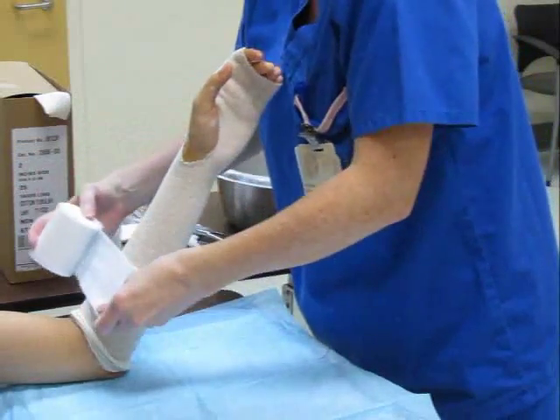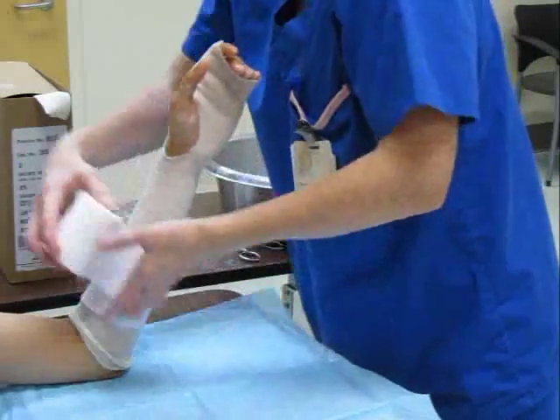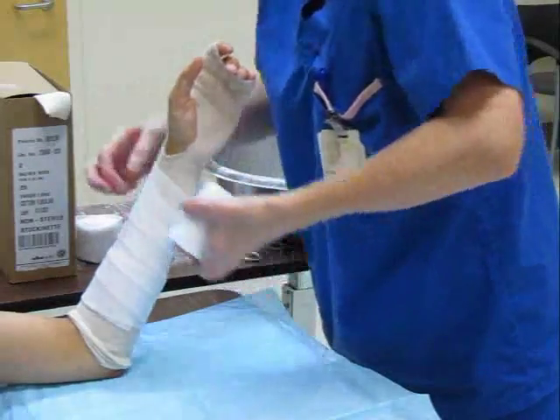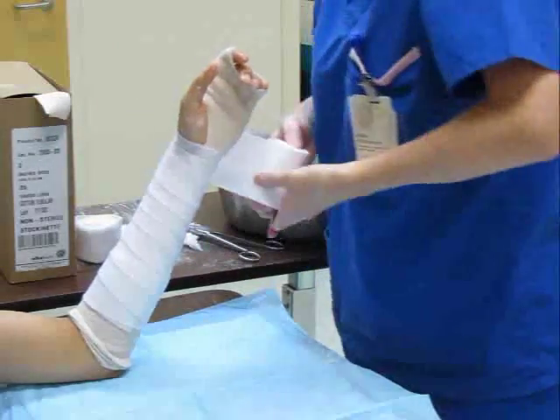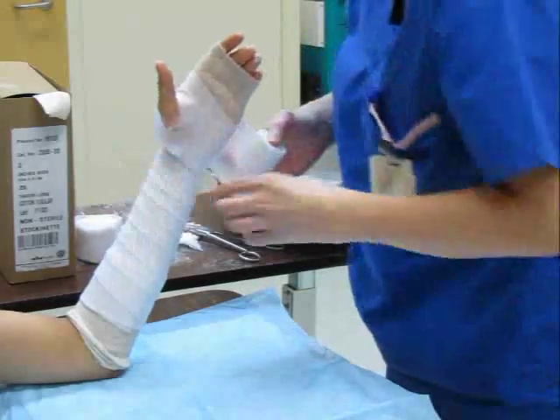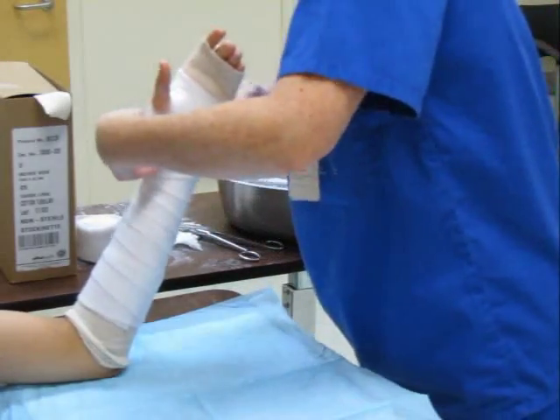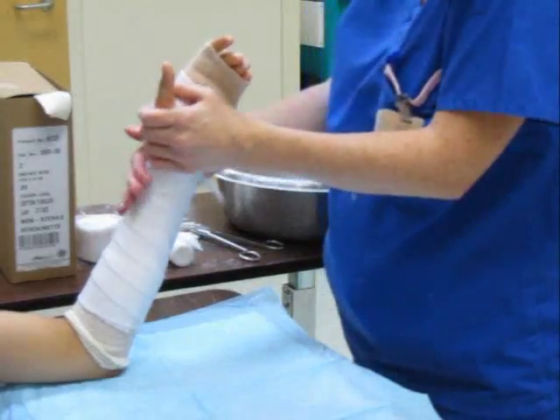Begin wrapping soft roll distal to proximal, starting approximately 2 finger widths distal to the elbow crease. Wrap two layers of soft roll proximally, and then proceed distally, overlapping by about 50%. Tension the soft roll throughout the wrap to avoid bunching. Wrap in a criss-cross fashion around the hand and wrist, tearing soft roll while passing through the first webspace. Ensure that there are two layers of soft roll on the hand, extending no further than the palmar crease to leave the metacarpophalangeal joints free. Tear off any excess material.